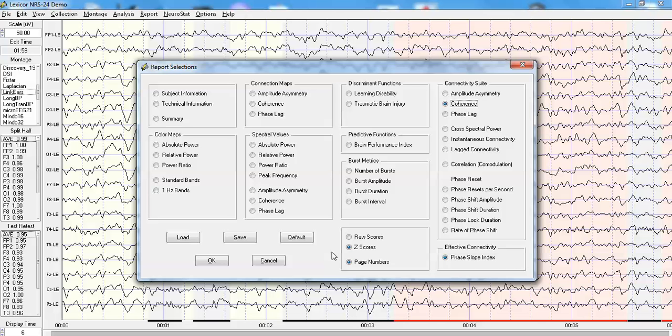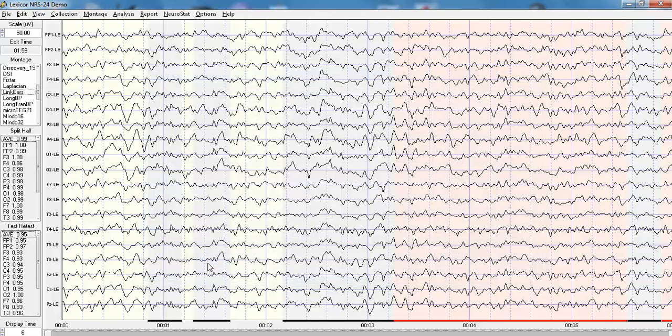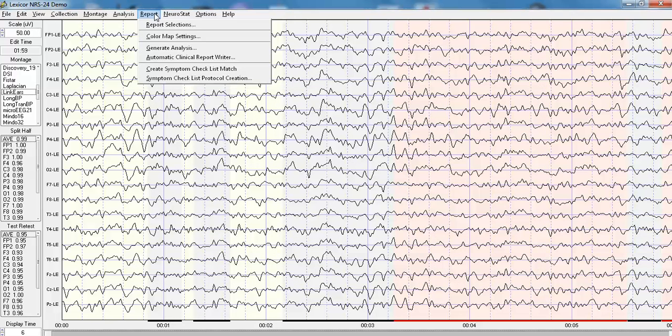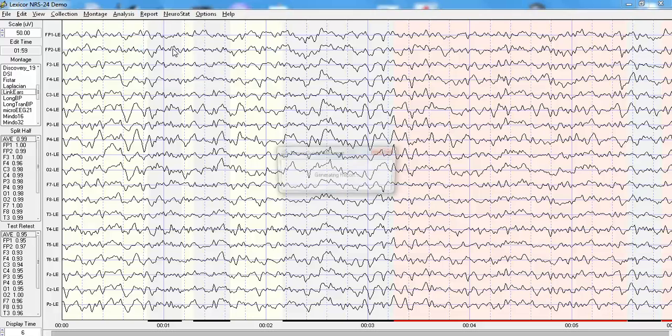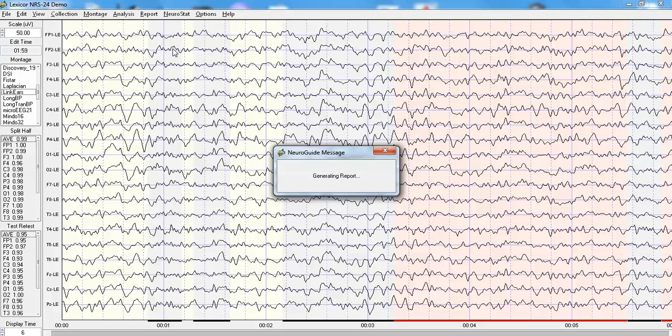So, now I've selected the z-scores, Phase Slope Index, and coherence. I'm going to click OK, then I'm going to click Report, Generate Analyses.